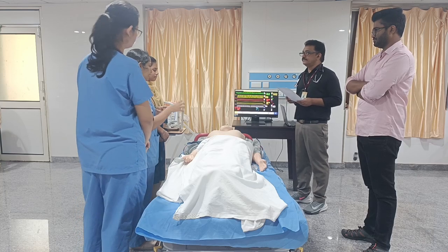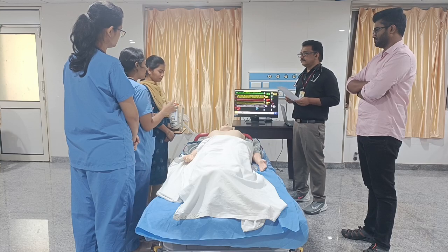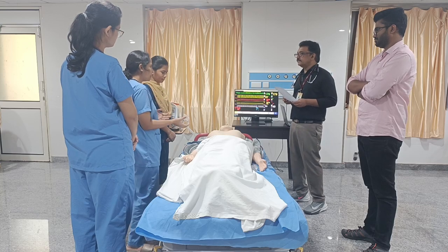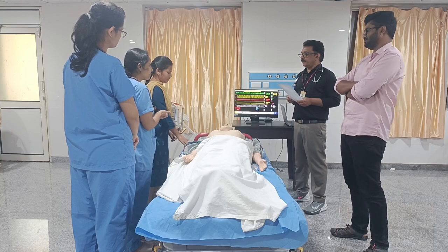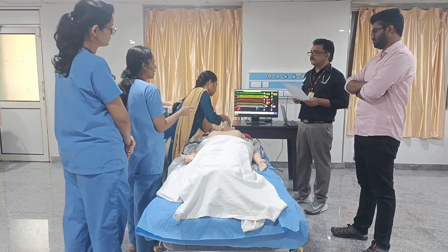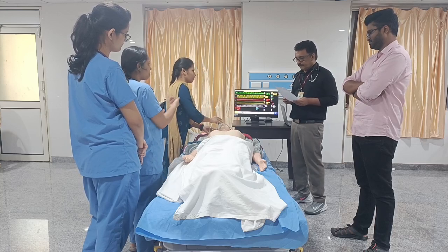Since in the breathing part saturation is only 88%, we will have to connect the patient to oxygen. We will supplement the patient with O2 via the face mask. Since on auscultation I have bilateral crepitations, we will also arrange non-invasive ventilation meanwhile. Connect to the mask. How much oxygen to be given? Since it is 88%, we can initially connect 5 liters of O2 and see whether saturation is picking up, and we can maintain a saturation above 90.